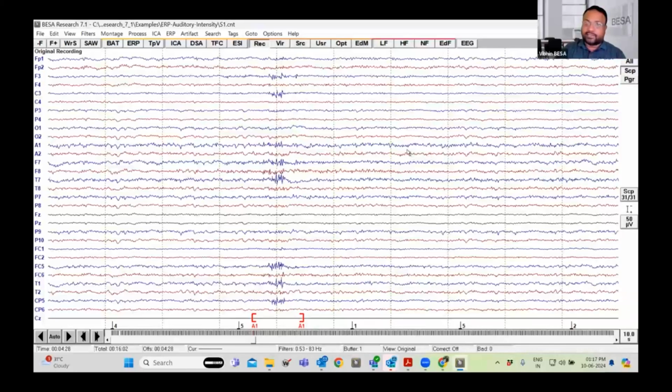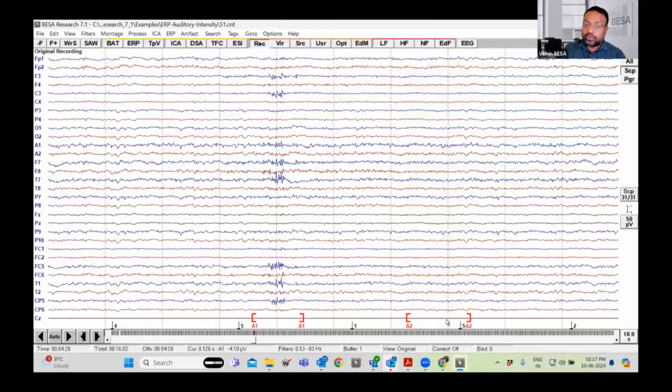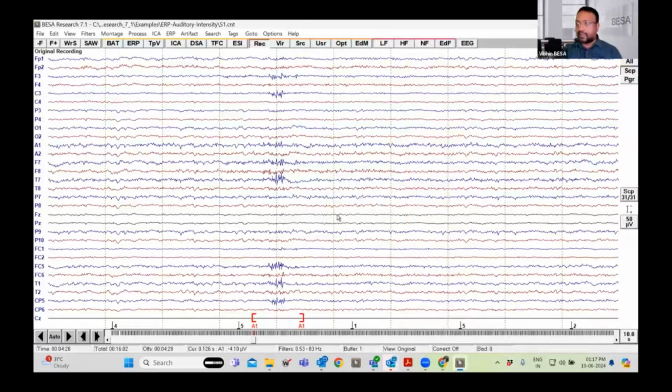Now suppose there is another activity over here. You can click that and label it as artifact 2. Depending on the number of artifacts, you can just click and mark them. Now, since we don't have an artifact over here, I want to delete this. So I'm going to right click over here and choose delete. It asks whether you really want to delete this. Give OK, and it gets deleted. So this portion will be removed from further processing so that you can work with artifact-free data.